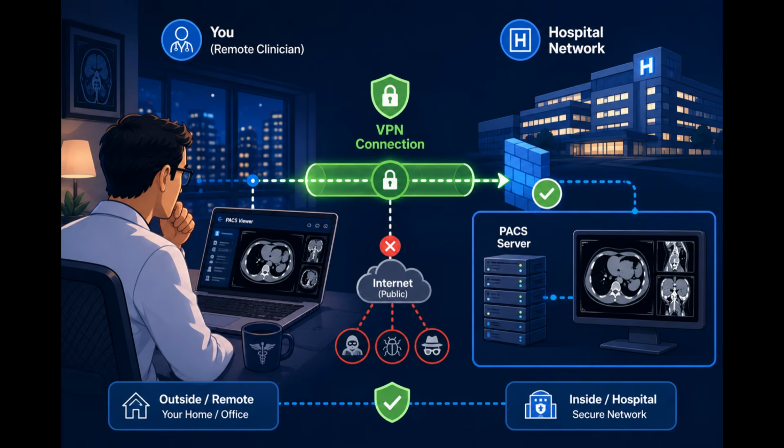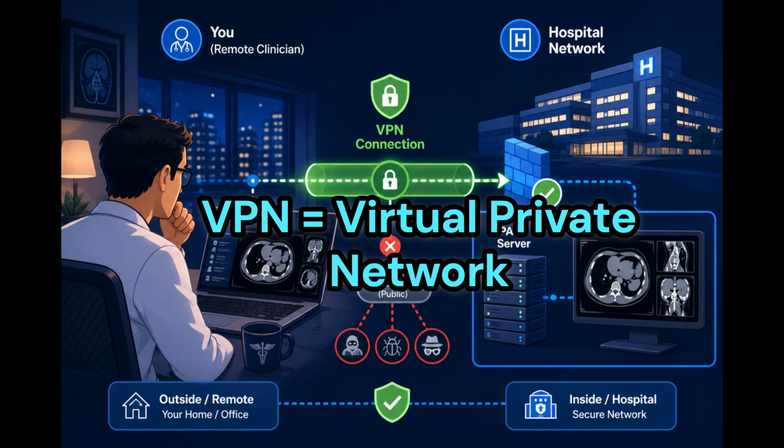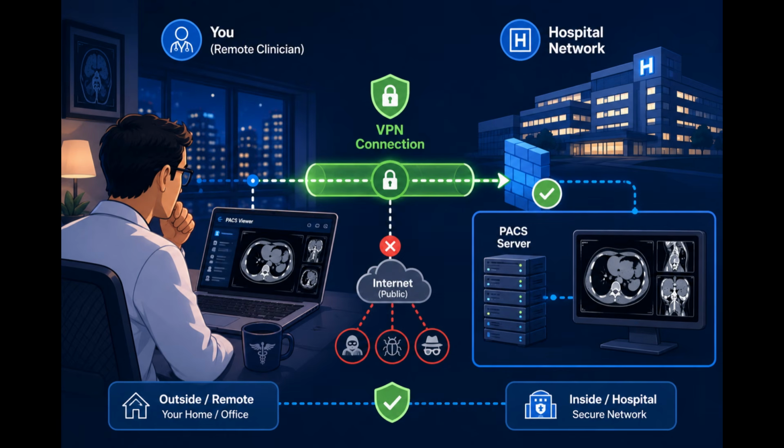Here's a step people miss. Working remotely, you're not just reaching out to the hospital across the open internet. Your laptop first connects through a VPN, a virtual private network, a private, encrypted tunnel between you and the hospital network, instead of your traffic traveling across the public internet where anyone could try to intercept it.